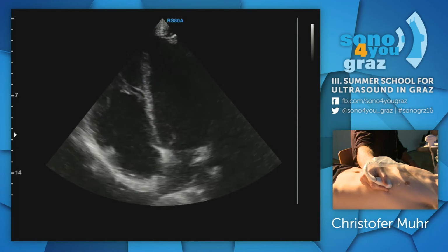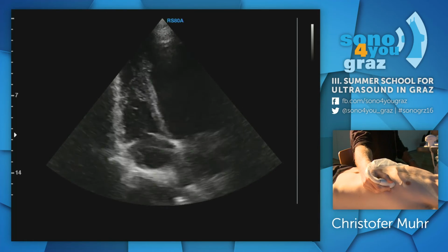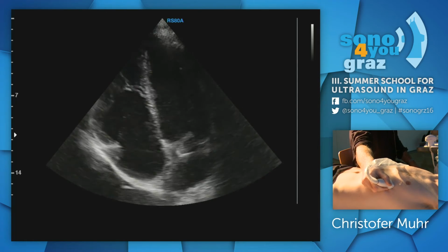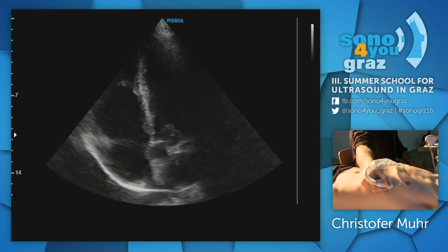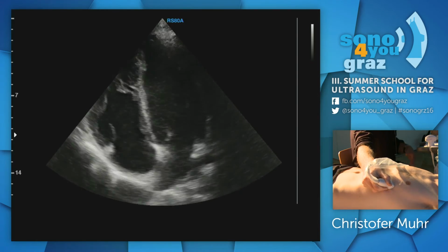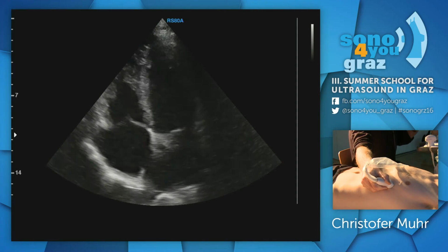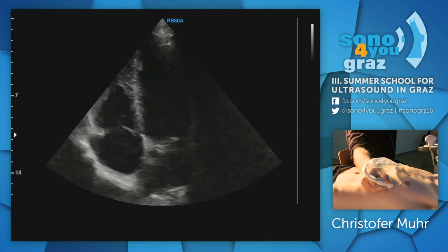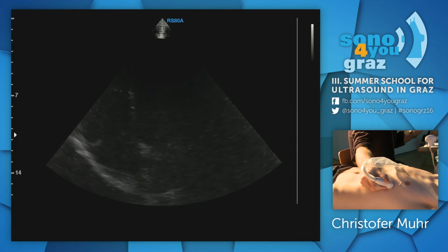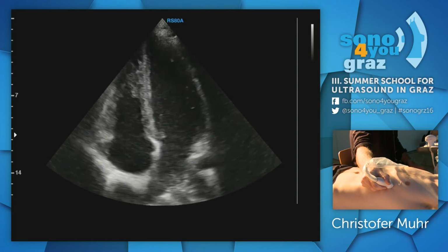If we want to see the aorta, sometimes we can just turn it a bit and tilt it, but now he's on his back, right? There comes the aorta in the middle of the picture. I think you should actually practice on patients being supine like this. If it doesn't work out at all, then make them turn. But most of the sick patients are not going to help you, and they won't turn to the left side for you. So practice on this, all right?